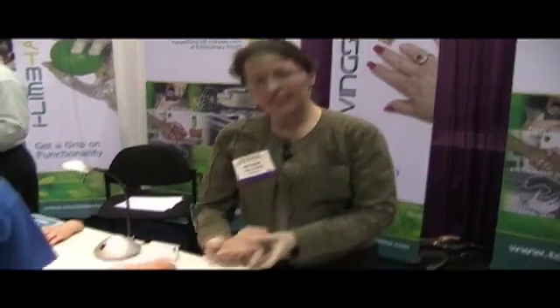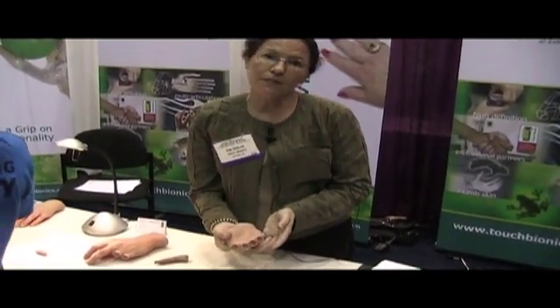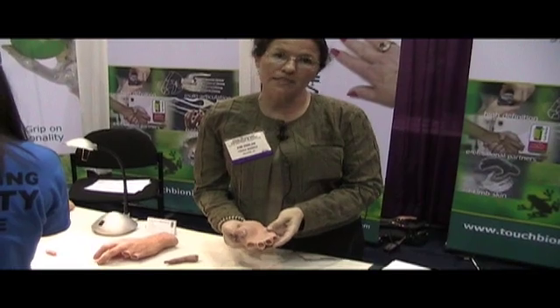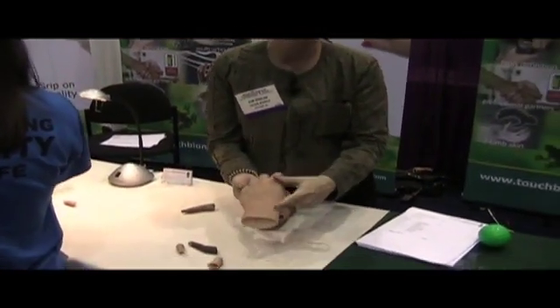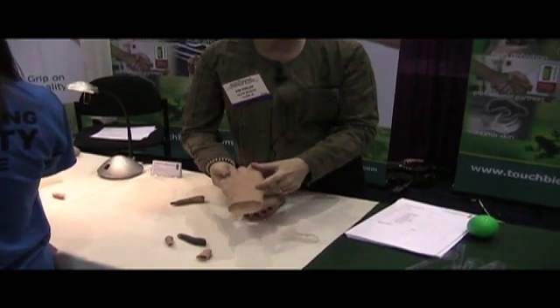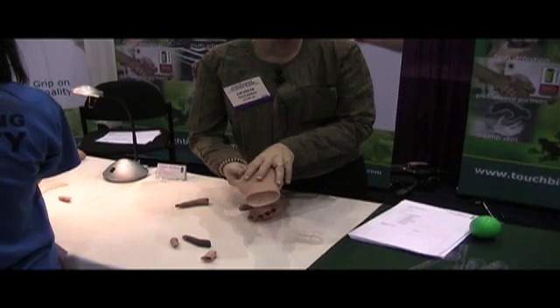Hi, I'm Kim with Touch Bionics and we make different prostheses for upper limb amputees. One of the prostheses we make is called Living Skin. These prostheses are considered passive functional prostheses. They are made from silicone and each one is custom sculpted and painted for an individual patient. We can incorporate things like hair, tattoos, or freckles to mimic the appearance of their sound side.